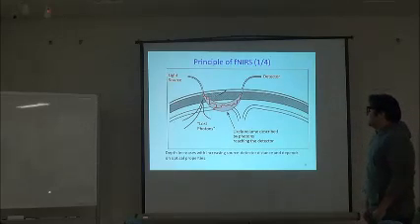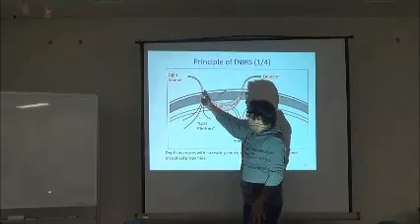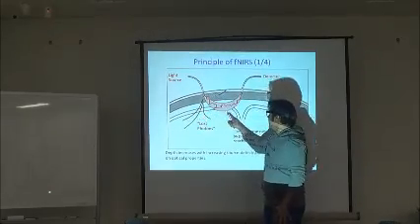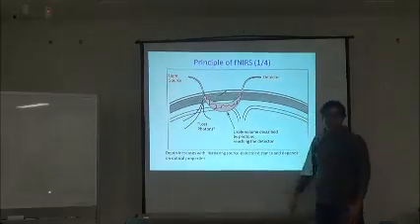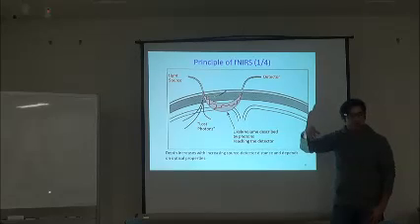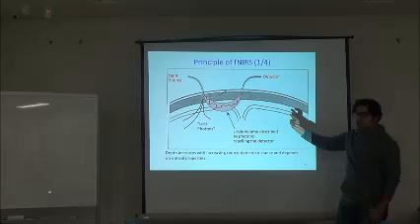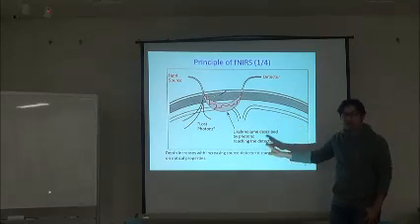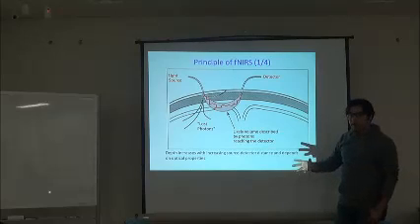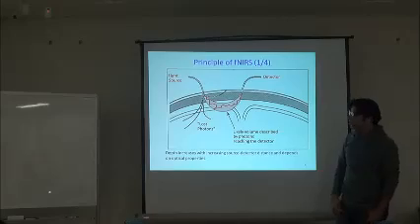Well, there it is. If we incident the light on this part here, it will scatter in every way. It will go there and everywhere. But if we want to image the cortical areas of the brain, we usually set the source to detector distance to be around 3 centimeters, because that is considered an optimal or approximately good distance to detect the cortical activities.